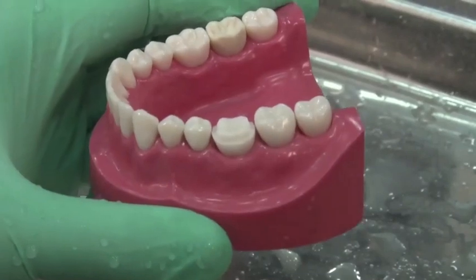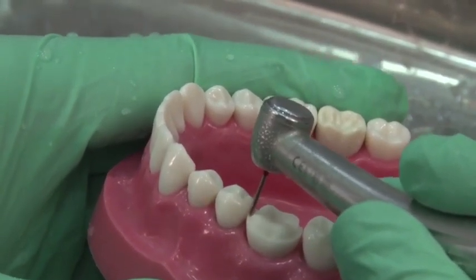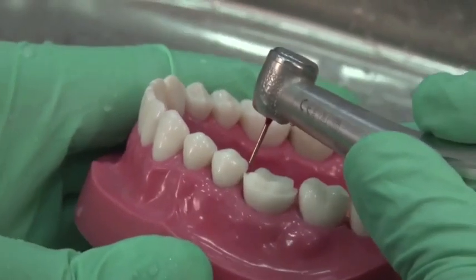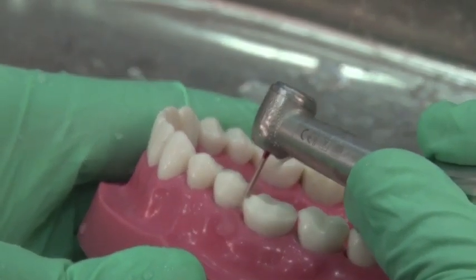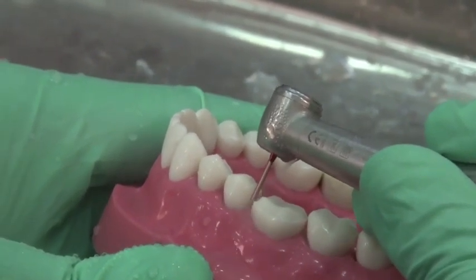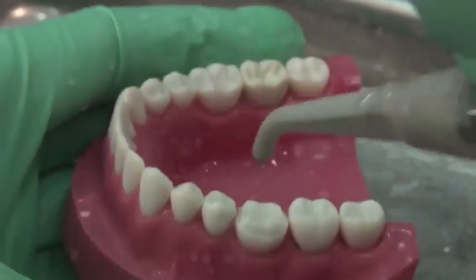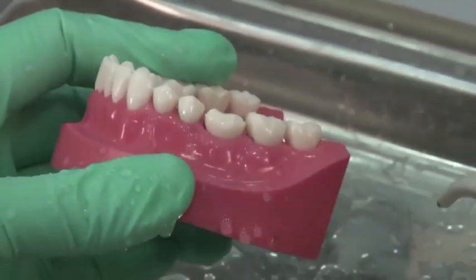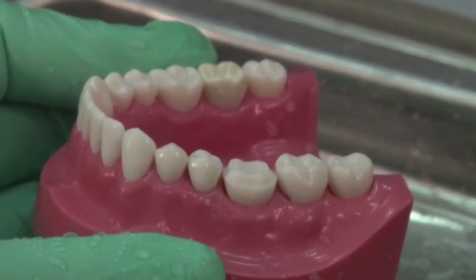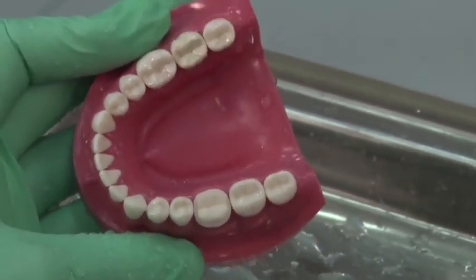You can decide whether to open the proximal contact or not. Distally the contact is open; mesially it is still maintained. The end-cutting bur — from the advanced bur kit — is used because it will run only on the enamel of the proximal wall without nicking the adjacent tooth. Go from lingual to labial to decrease the possibility of nicking the adjacent tooth. After running the bur across, dry the surface — the proximal contact has been opened without hurting the adjacent tooth. Run a Sof-Lex disc to smoothen the preparation beautifully.